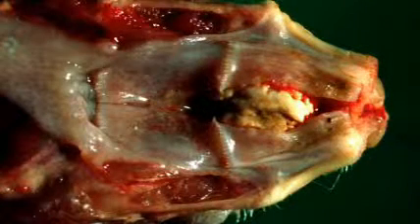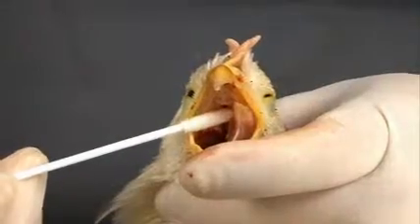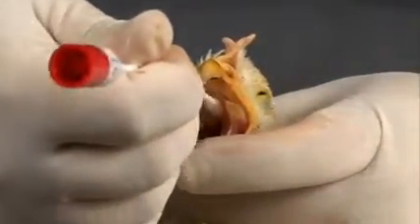Birds do not form liquid pus, and inspissated exudate tends to accumulate in the choanal orifice. If exudate is present, you can collect a swab sample from the choana or trachea at this time. Just caudal to the choana is the infundibular cleft. This is the opening to the eustachian tube, and is surrounded by ridges and rows of sharp, well-demarcated papillae that point caudally. A variety of diseases can damage the papillae, resulting in blunting.